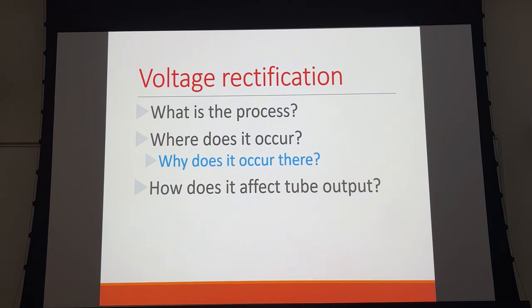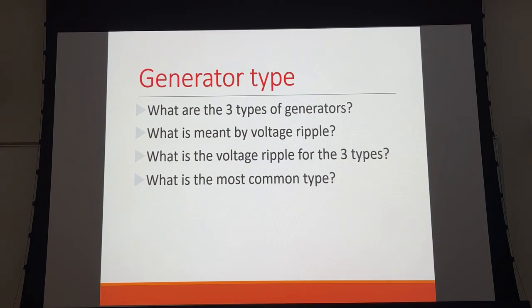We not only transform alternating to direct current, but we utilize that negative side so that we send the entire voltage waveform across the X-ray tube. So it doubles it. And really the effect on the voltage waveform is going to look an awful lot like our increase of mAs. It's just going to increase the numbers.